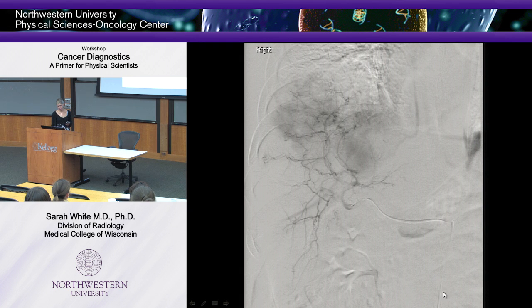So here's my catheter. Again, we're using digital subtraction angiography, and you can see, everyone see this? This is what normal liver looks like on angiography. Okay, you should just see these beautiful, beautiful, they look like roots of a tree, very straight, very sharp. And you can see when you look up at the top of the image, they're squiggly, they don't look right. You can even see a little one here, right? So that's probably one of those small tumors we saw on the DWI imaging. And here you see these big, almost look like cannonballs in the middle of the liver. So those are his tumors.